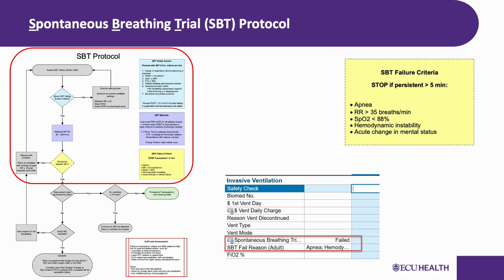Second, it creates a longitudinal record. When you screen the patient again tomorrow morning, you can look back and see what happened yesterday. Is the patient trending in the right direction? Are they failing for the same reason or a different one? This pattern recognition helps guide clinical decision making.